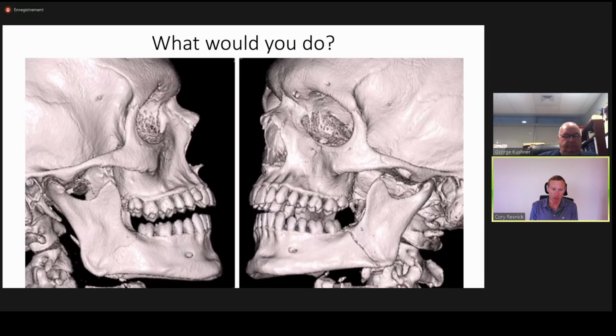The need for perfect anatomic reduction has a lot to do with the height of that mandible, whether you might need some bone grafts to help support optimal healing, whether you're talking about mini plate fixation, or because it's a very short edentulous mandible, we may be thinking more rigid fixation with reconstruction plates. Anatomic reduction of the fracture patterns, meaning seeing visually the fractures align properly rather than using the dental segments to control the position of the fractures, becomes much more important in an edentulous fracture than it would be in a dentate fracture. But maybe Dr.